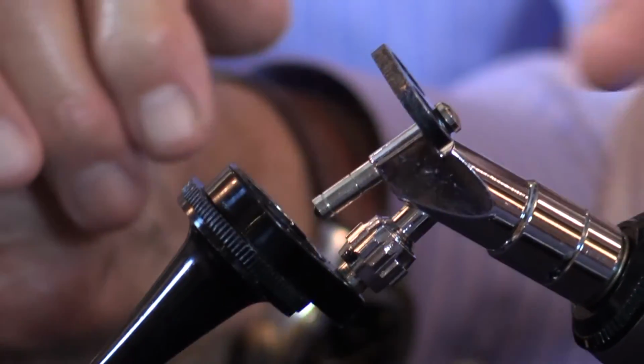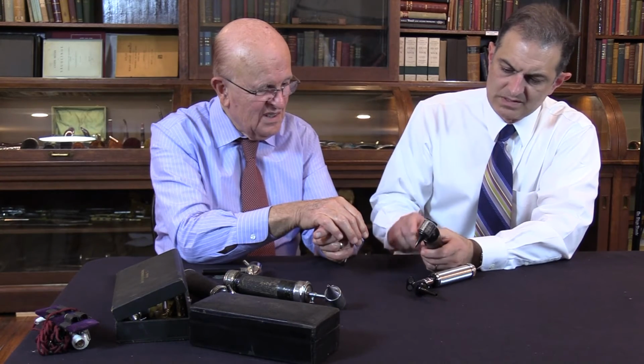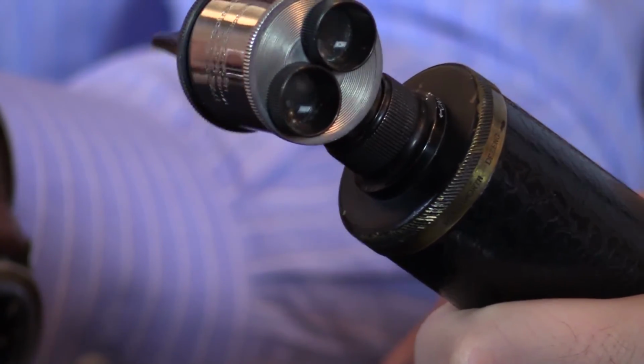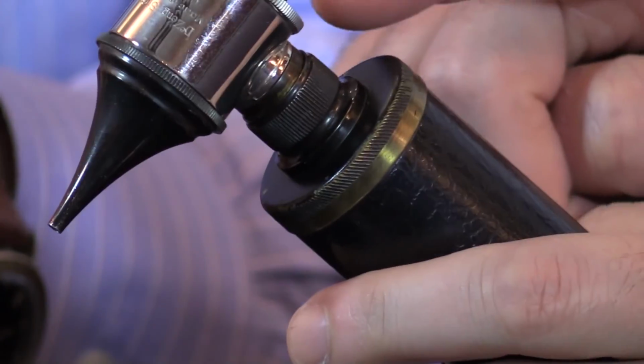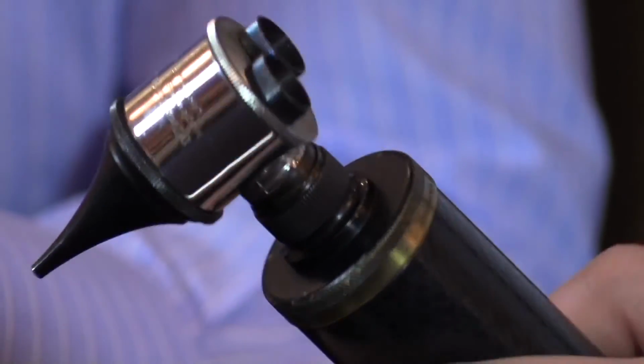And the other one's a little more superficial, and this is one that's with a closed head. The same idea, one lens. It almost looks like it's a binocular lens, but obviously it couldn't be with them spaced so closely. But when you look closely, there's just a different shaped lens.